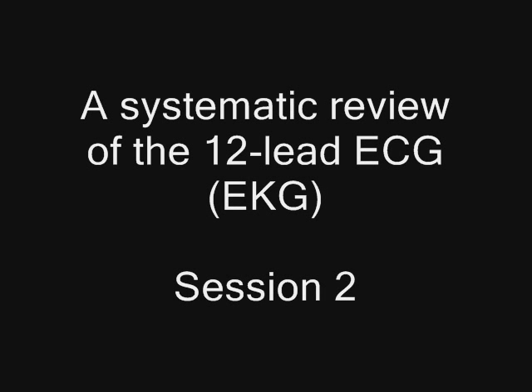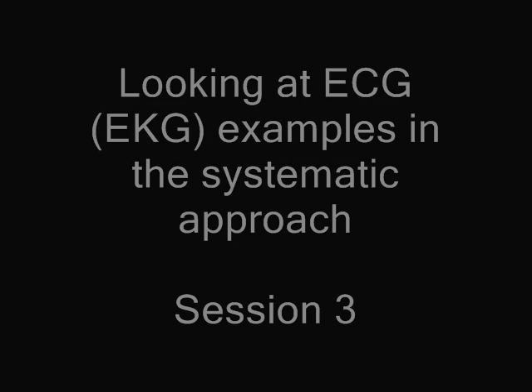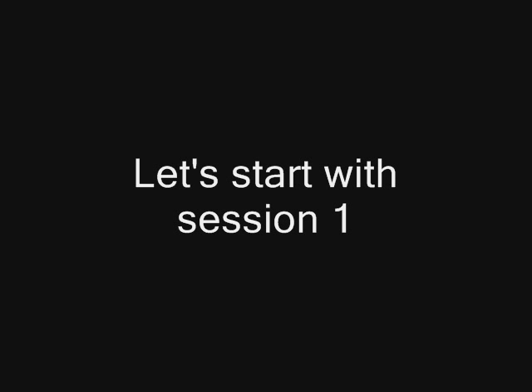In session 2, I'll take you through a systematic review of the 12-lead ECG, a short but very important session. In session 3, we'll look at examples together in the systematic approach. And once you've finished, the quiz is yours to self-test against. Okay, so if you're ready, let's start with session 1.